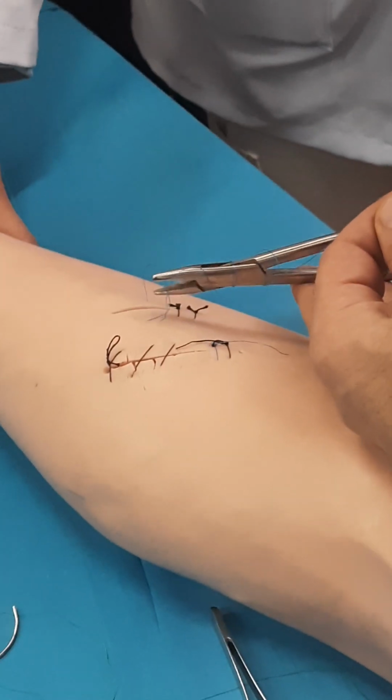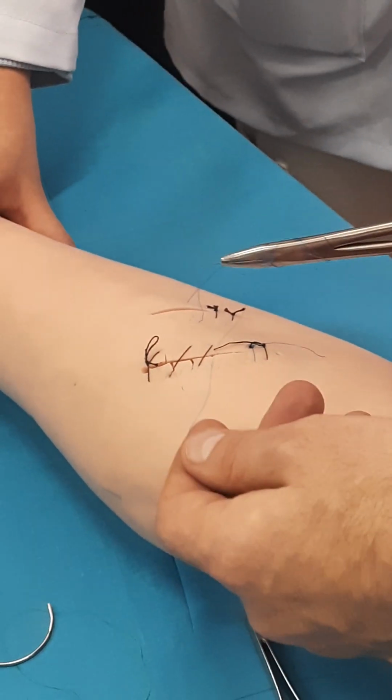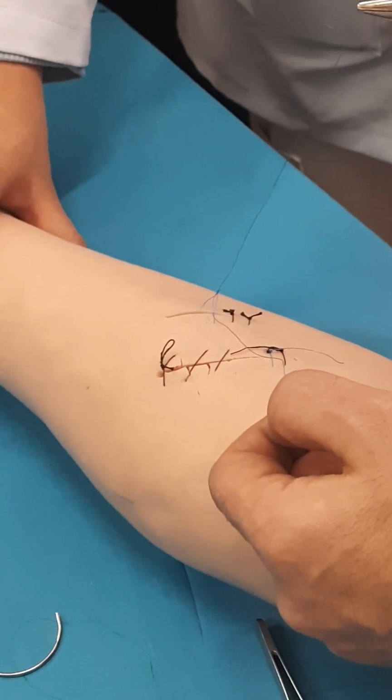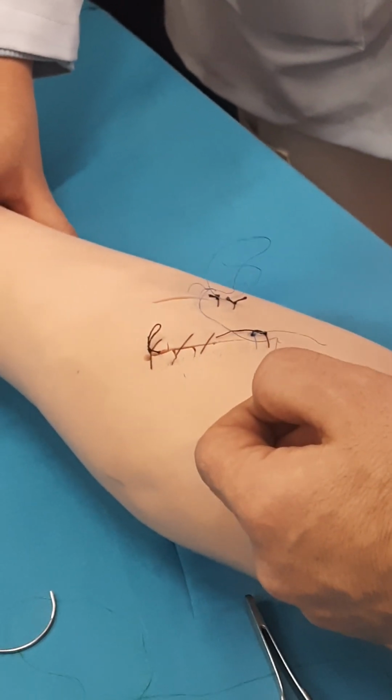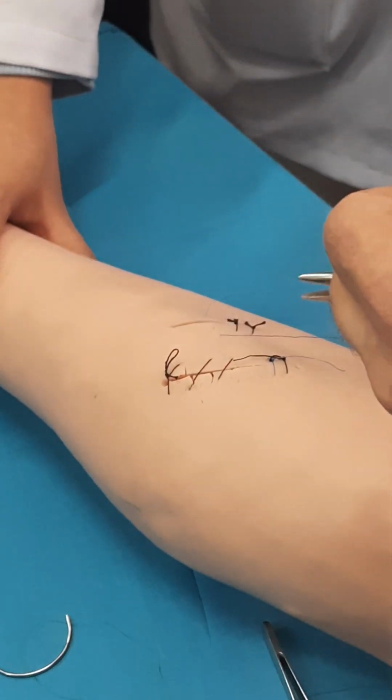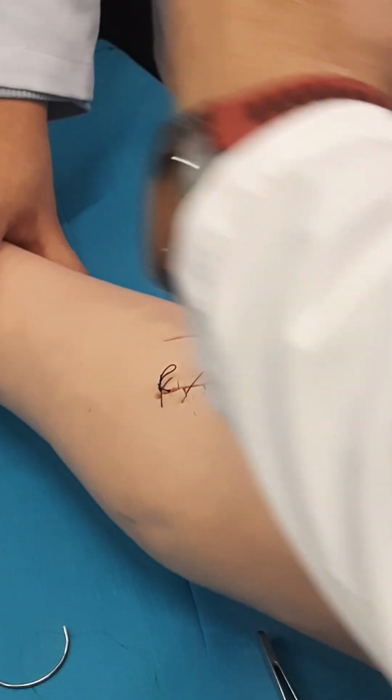Then I make fixation. And look, don't pull this end. Otherwise, you will cut big pieces of the thread, and after two sutures, your thread will be finished. Vice versa. Then you make the knotting. Tense that one. You understand me? Yes, sir.